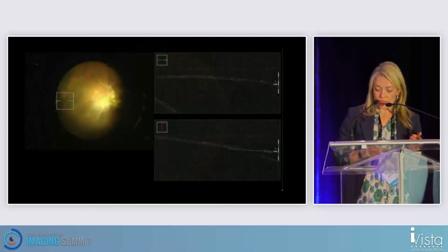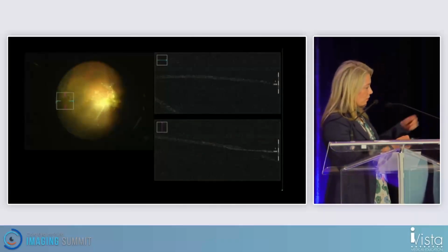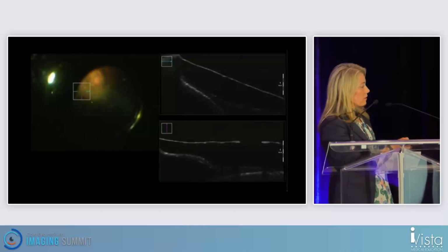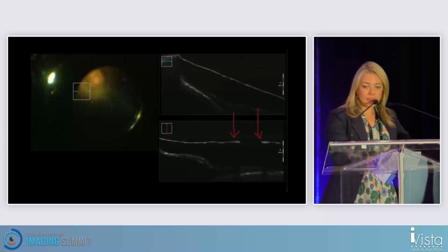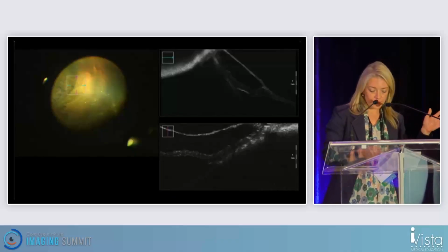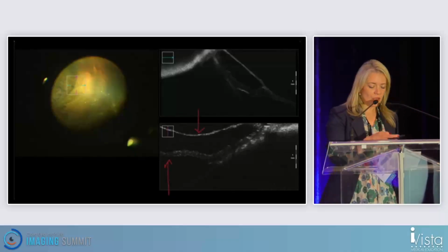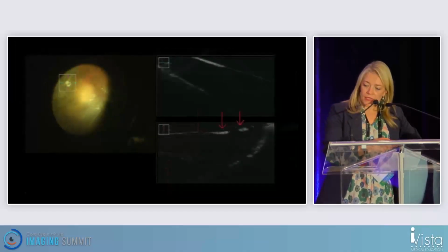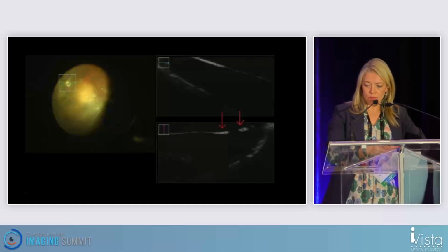And so in this case, intraop OCT was super helpful. You see this thin inner retina. There's the edge of the outer retinal defect. And then we found, all the way in the periphery, a totally separate inner retinal defect. You see how there's two cavities, and the outer and inner retinal defects in this case don't communicate. They're separate. In the first case, they were on top of each other, but here they're very distant from each other. And you have these two cavities. We mark it so we don't lose it.